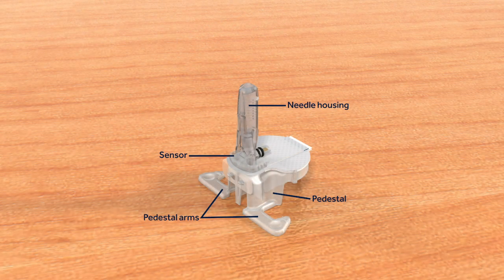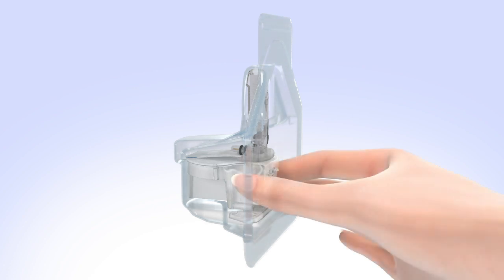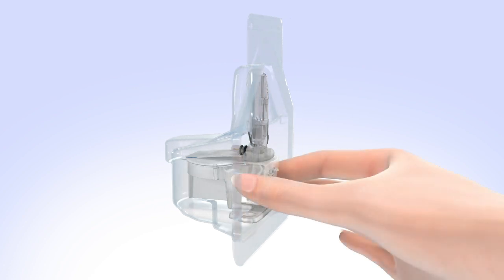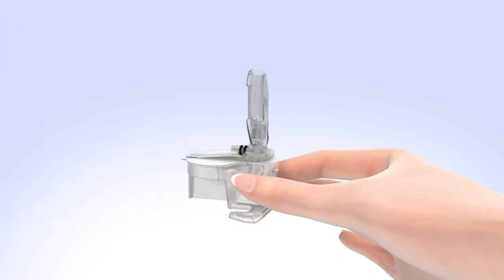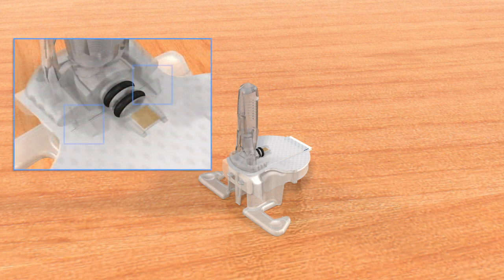Let's take a closer look at the Guardian Sensor 3. Open the Guardian Sensor 3 package and remove the sensor by holding the plastic pedestal. Do not hold it by the sensor or needle housing, as this could damage the sensor. Place the sensor with pedestal on a clean, flat surface such as a table. Make sure the sensor's adhesive tab is tucked under the sensor connector and snaps.